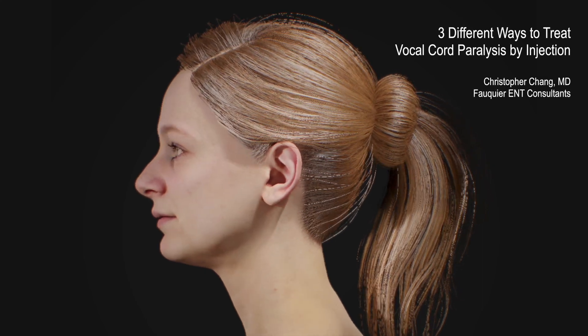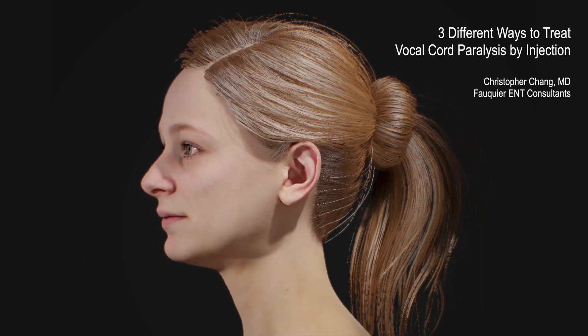Demonstrated here are three different procedures to help restore a normal-sounding strong voice for a patient suffering from a paralyzed vocal cord.